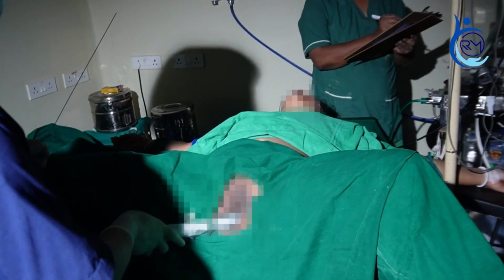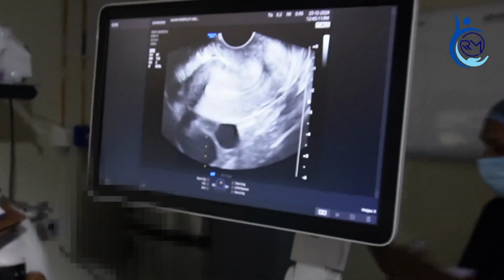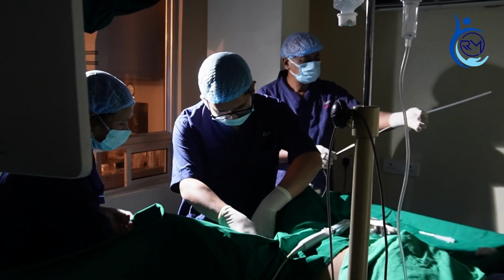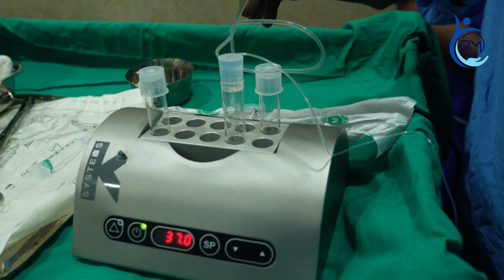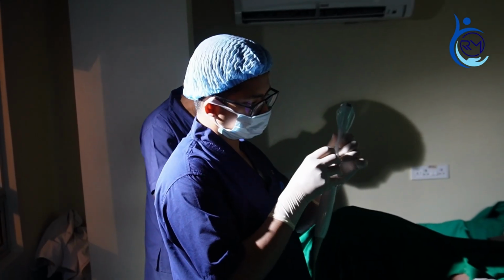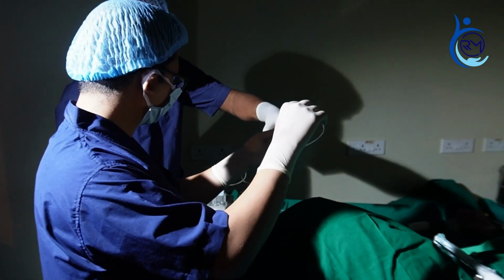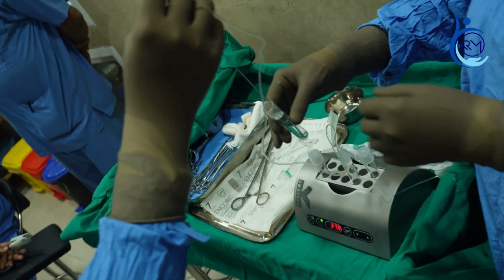A transvaginal ultrasound probe equipped with a needle guide will be inserted into the vagina, and a quick scan will be performed to see that everything is okay. The doctor will visualize your ovaries and check the access of the needle to your ovary first. Before the actual procedure, your doctor will verify some important things: the suction pump will be checked to see that it is functioning properly, and the pressure will also be checked. The connection between the needle and aspiration tubing is examined for any cracks or leaks. The ultrasound probe, protective sheath, and needle guide are inspected to ensure proper placement, and a mock aspiration is performed with the culture media to ensure all systems are working correctly.